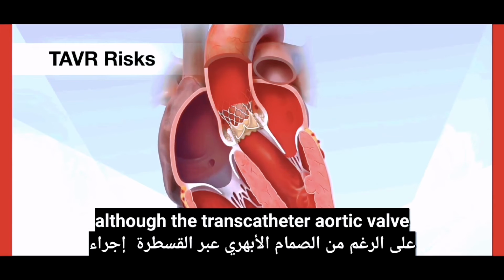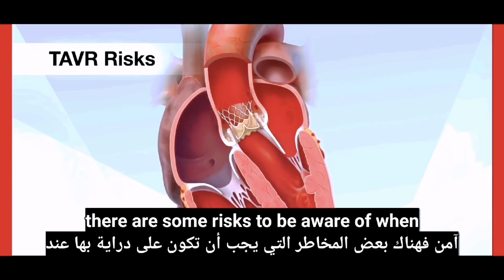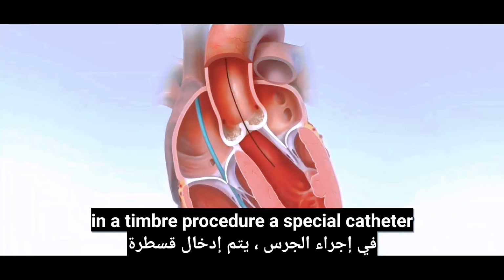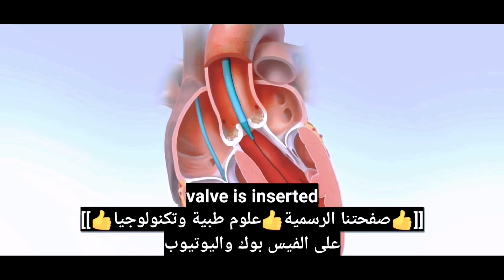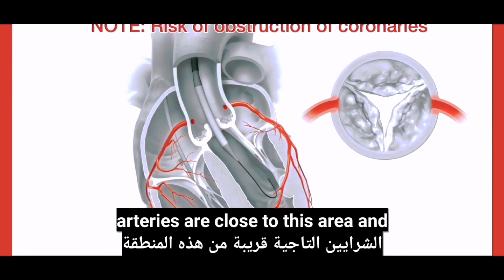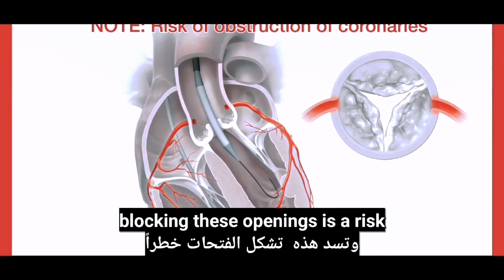Although the transcatheter aortic valve replacement, or TAVR procedure, is safe, there are some risks to be aware of when considering a TAVR. In a TAVR procedure, a special catheter that contains a collapsed replacement valve is inserted. Note that the openings to the coronary arteries are close to this area, and blocking these openings is a risk.